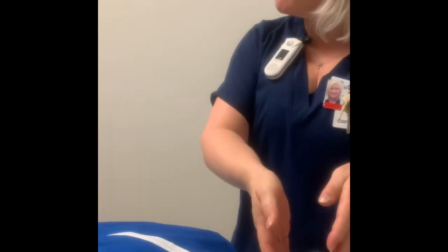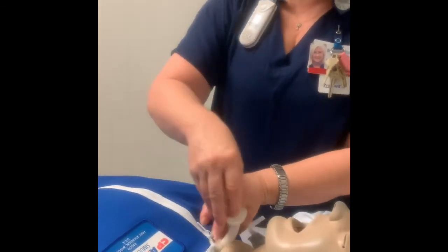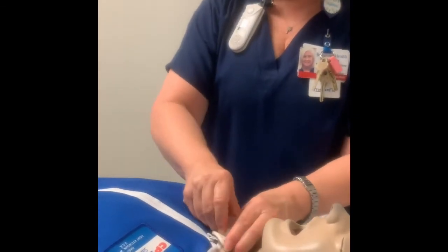So, I'm gonna ventilate here. Why? Because I don't have an upper airway. It's gone. My larynx is completely gone. And of course, they can't talk to you because their vocal cords are in their larynx. Okay? But you should always know what kind of airway you're dealing with here. That's why we call this the Altered Airway Initiative, real big here at Banner.